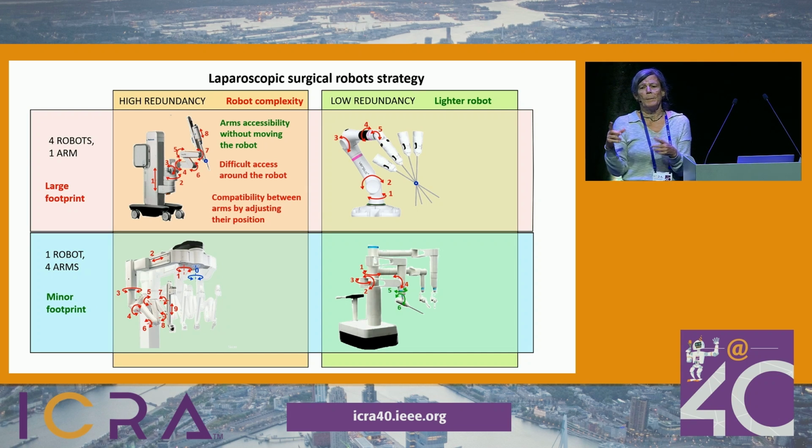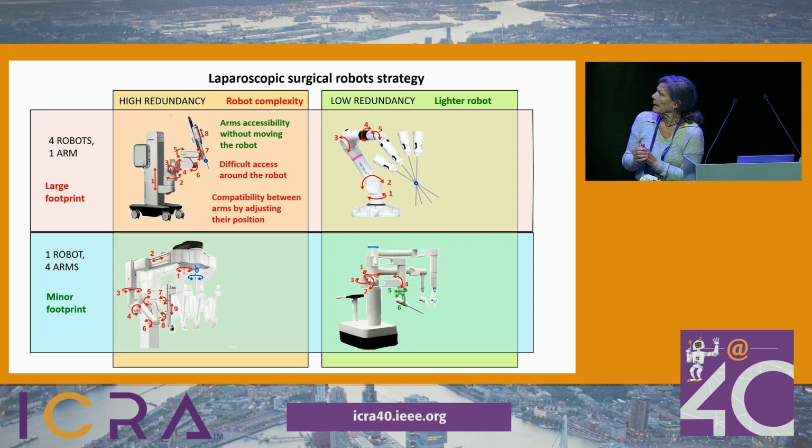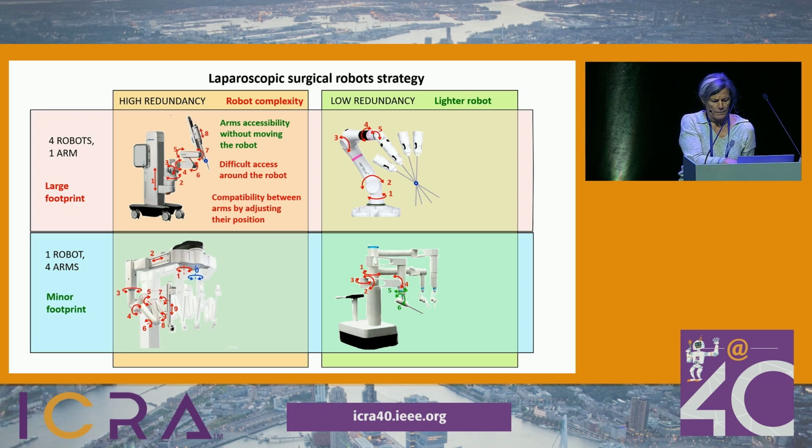One degree of freedom can be automatized. We can fix some parameters to deal with the redundancy, even a function, depending on the distance, depending on the movement of the other arms, you can control how to manage the redundancy. But when there are more degrees of freedom, the computation explodes, and all this positioning is done manually with an effort from the specialist.